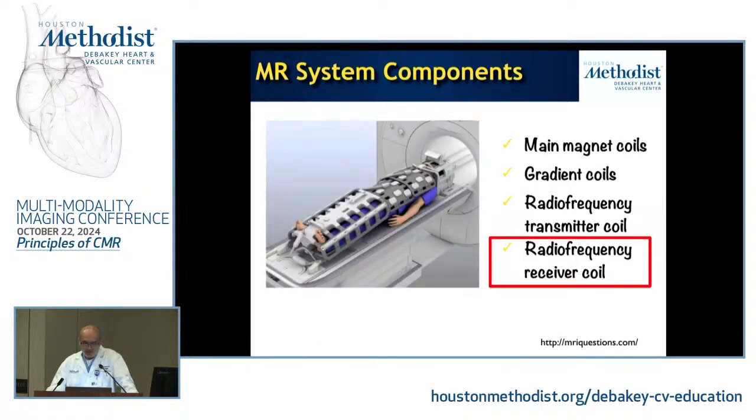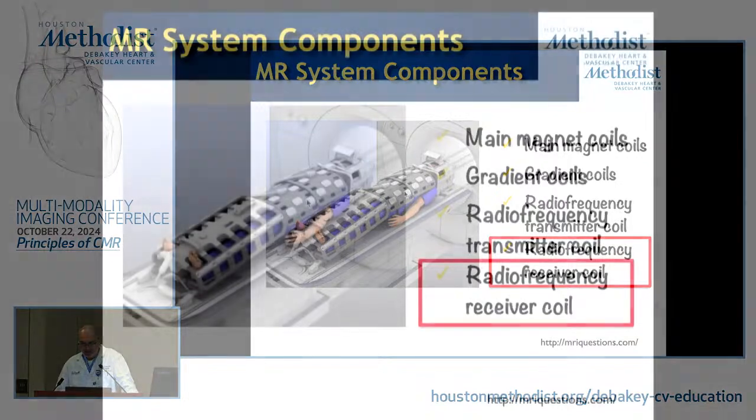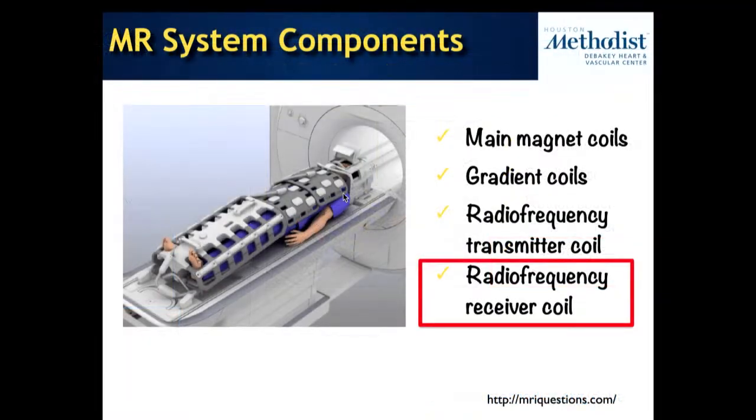Now this is a patient, if you want to do kind of total body imaging, where it's almost like a full metal jacket, right? Where you've got a head coil that's put here, and then you've got surface coils all along from the chest, the abdomen, and the legs, right? And again, where would you do this much would be if you want to do like a vascular study where you want to go from carotid down to toe or something.